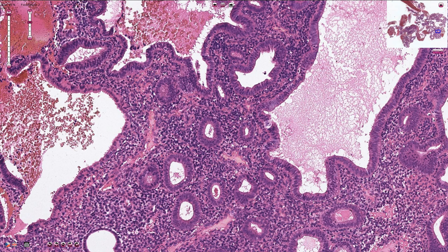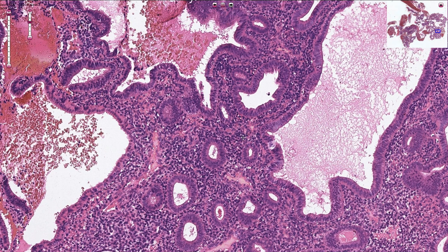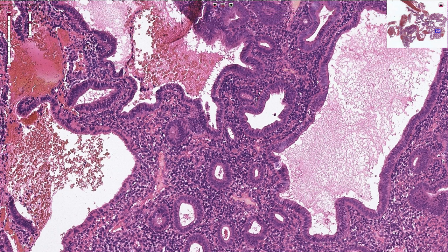Endometrial hyperplasia can be differentiated into typical and atypical subtypes, and here we have the example of typical endometrial hyperplasia associated with hormonal imbalance.